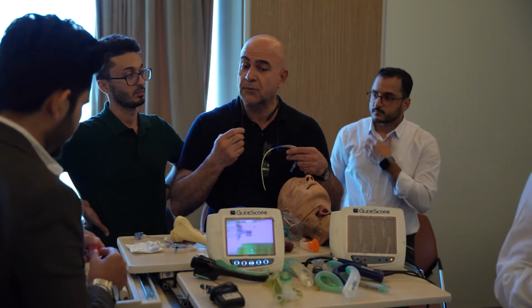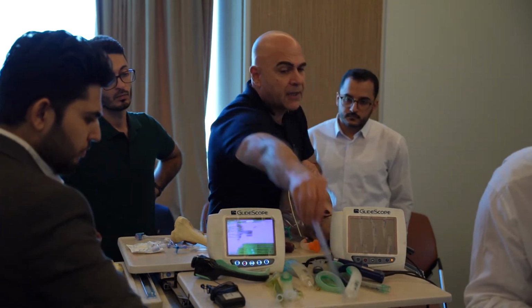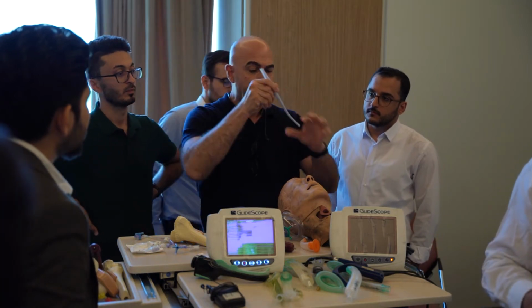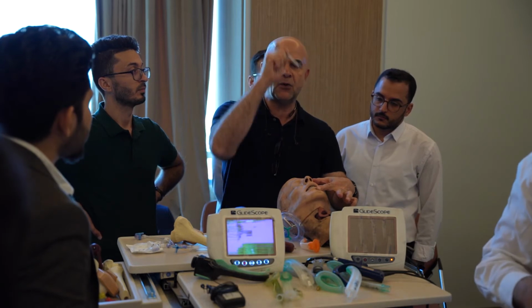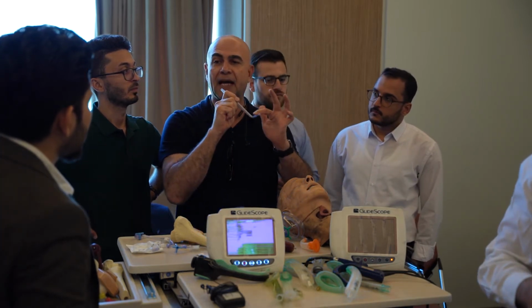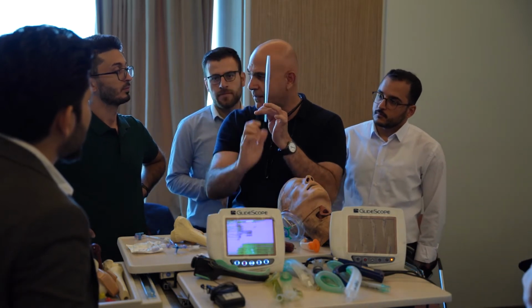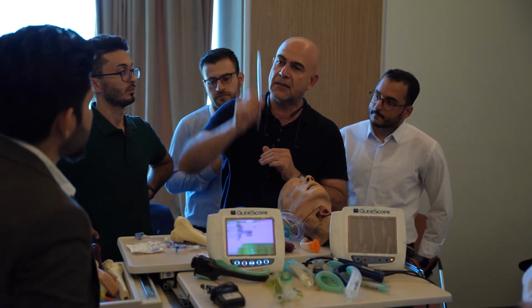There is also a tube called a bougie, something like this, similar but thinner. This bougie has an angulated end. You introduce the bougie into the trachea and manipulate it. You will feel the rings of the trachea through the bougie, and you advance the tube over the bougie and then extract the bougie.